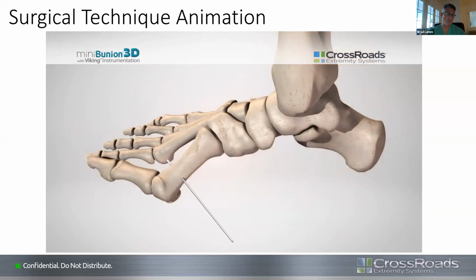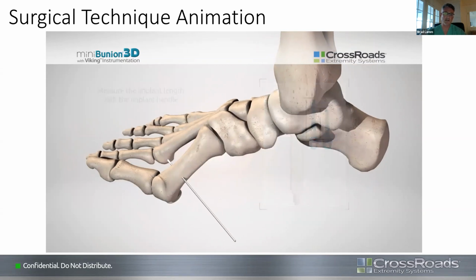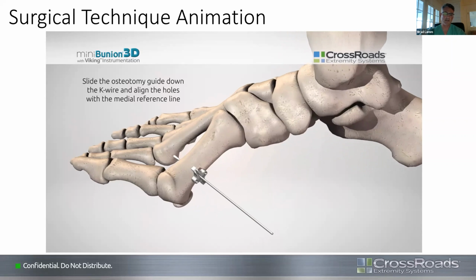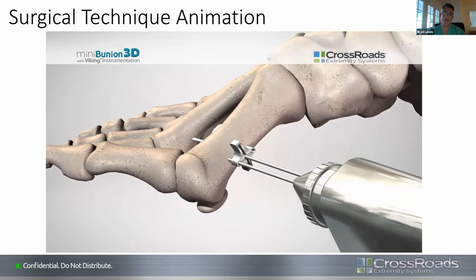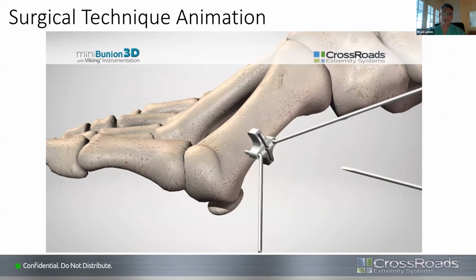Make a small 2-centimeter incision, about a 1-inch incision. Then you measure for your lengths. There's a short and a long, and that measurement allows you to figure that out. Here's the osteotomy guide. It slides over the first wire. Then you put 2 wires in, one distal, one proximal, and then you bend those wires so the guide stays in place.